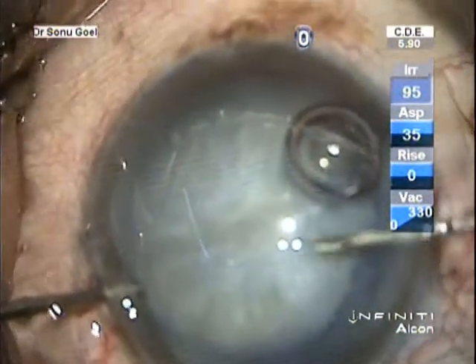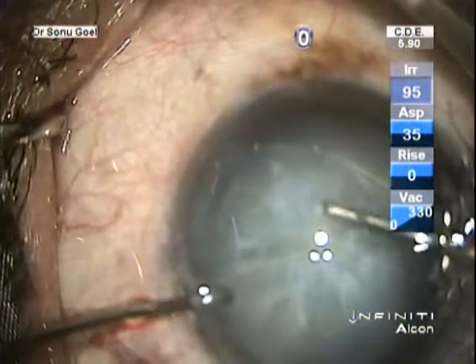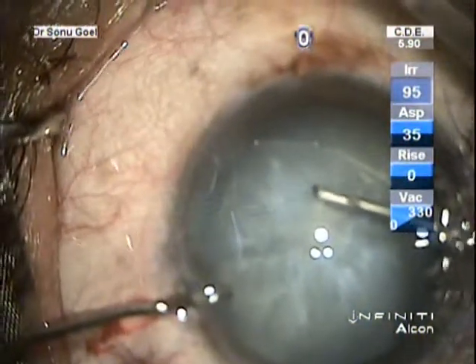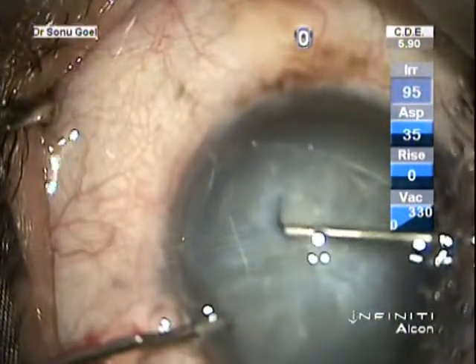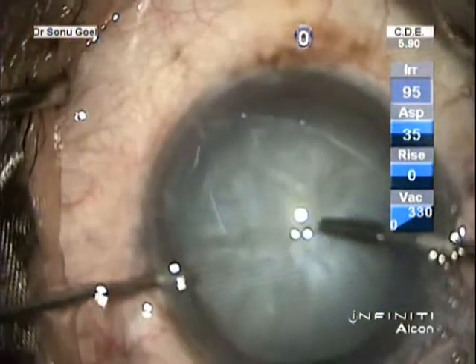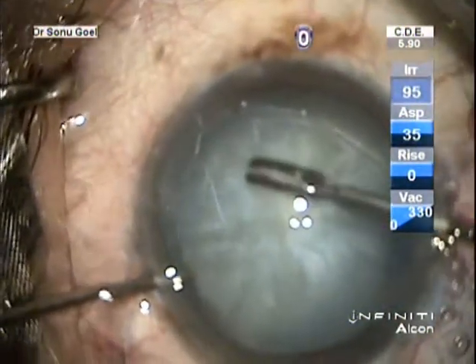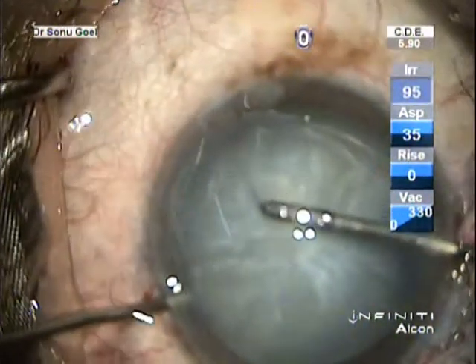Another white cataract, high intralenticular pressure. A nick is made with a cystiotome. Note is made the viscoelastic is being injected. The flap can be lifted easily. A micro rhexis forceps can then be used to complete the rhexis in a circular fashion.